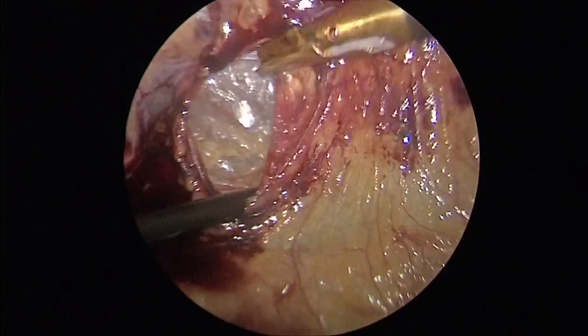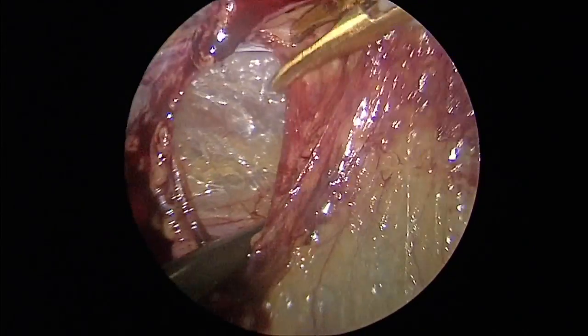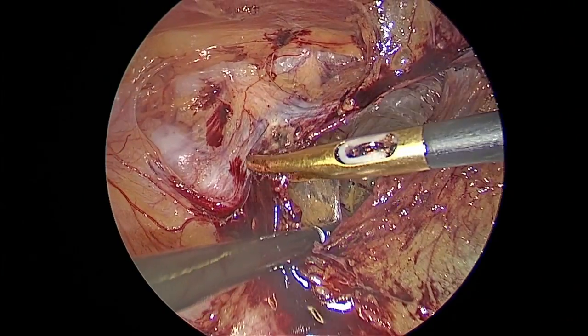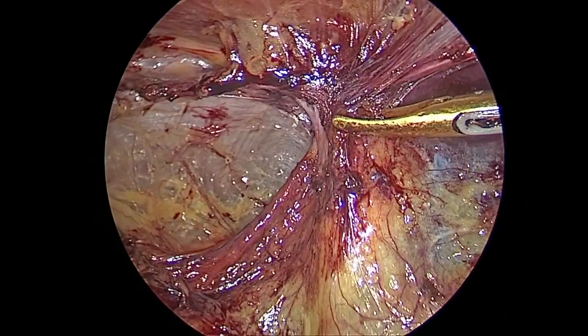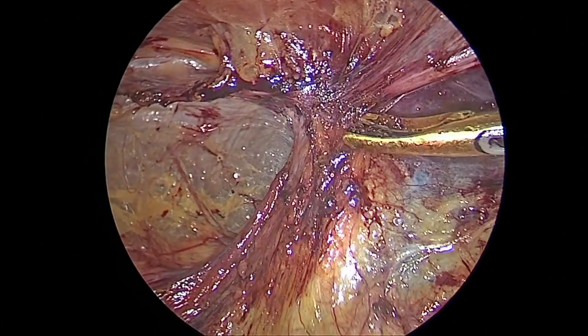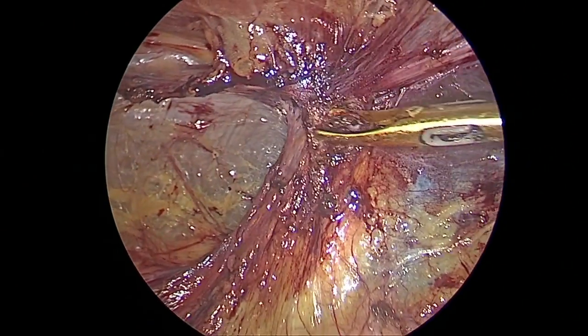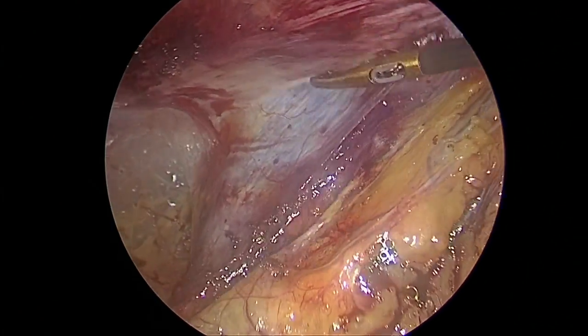What this has done is there is PRS on my right side of the screen and PRS on the left side of the screen, and this will create little difficulty later on, and we will realize how it has created this difficulty. So what I did was I worked on the PRS and then dissected the peritoneum away.